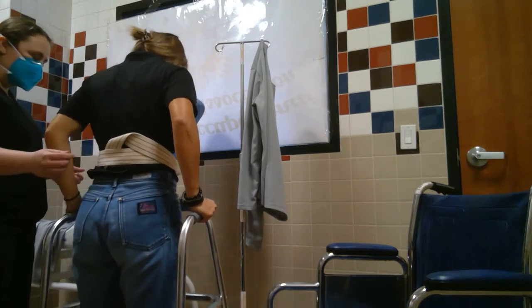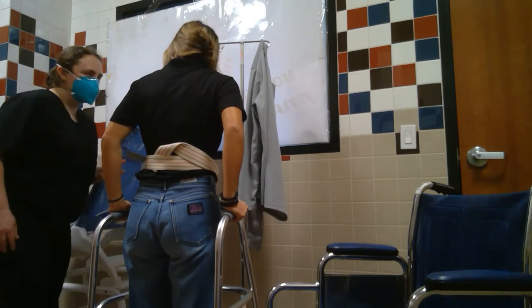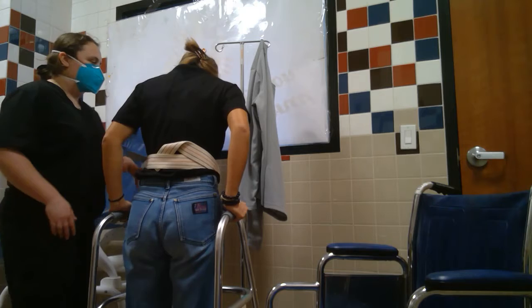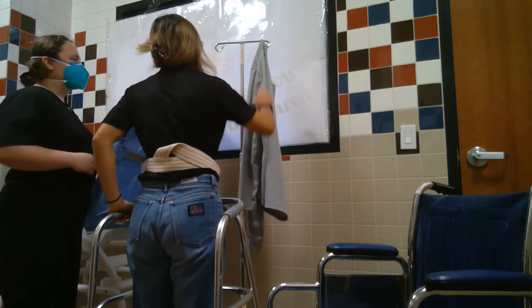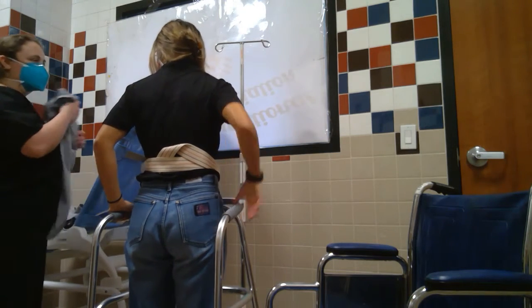So walker, surgery, non-surgery. And then same thing when you're turning. Great job. And remember, this is the safest way because you can't bend that leg too much, right? You don't want to push it backwards and you don't want to turn it. And so this is the safest way, the way that you just did it, you're barely moving it, so you're not really bending it. Okay. Do I take the shirt off? Yep, go ahead and take that off. And we'll hang them up one more time and take them down, and then we'll be good.